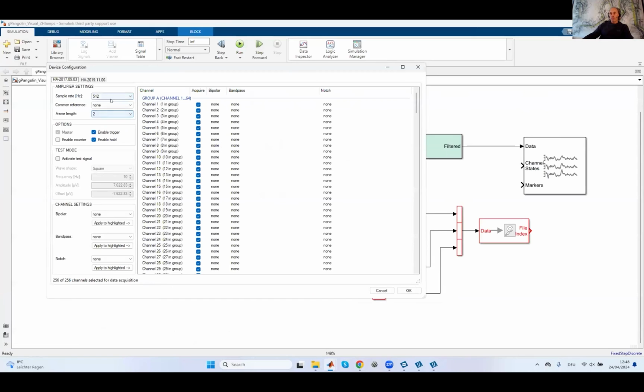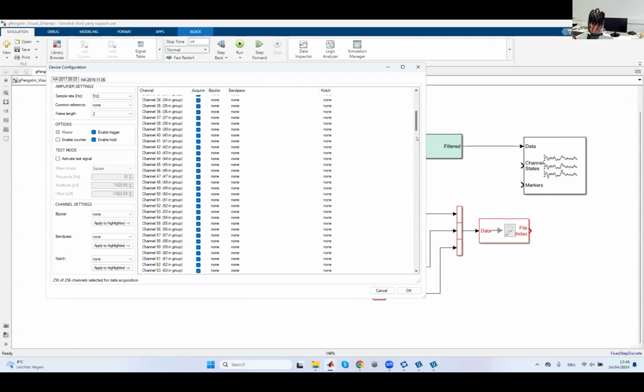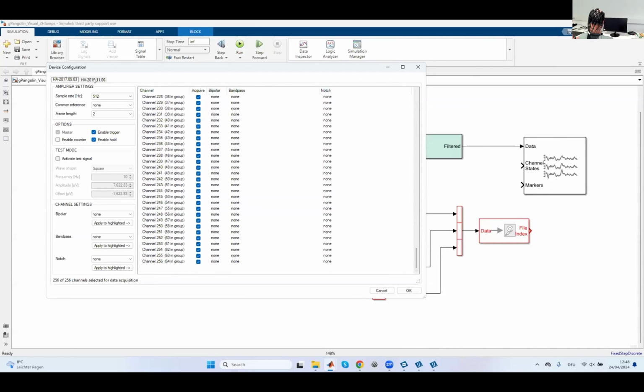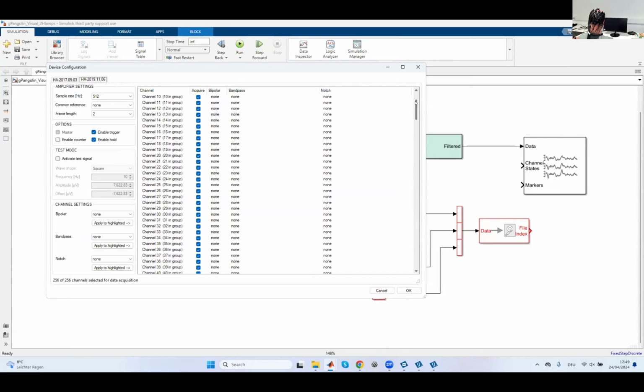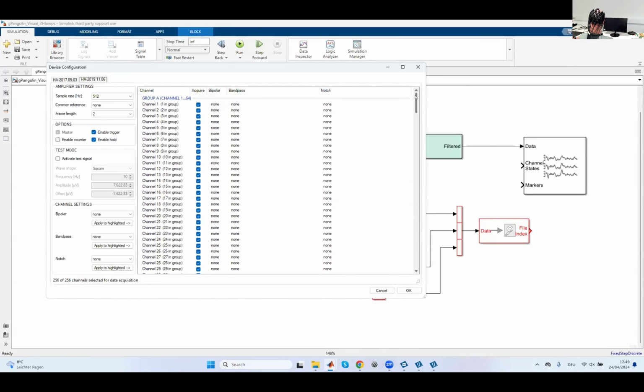Could you work with dry electrodes as well? No, we didn't have that. Basically, it's a very complicated topic to work with dry here, because we need the exact coverage of this little dot, and we don't have a lot of space if you want to place so many electrodes. So we need contact with gel on the skin. Being dry would mean placing electrodes on the scalp with no conductive gels, which of course would reduce the signal quality.